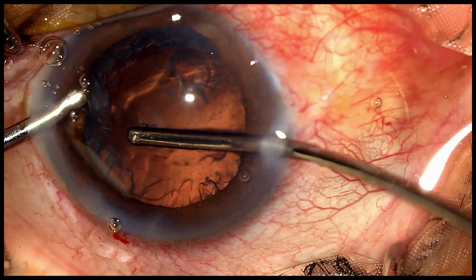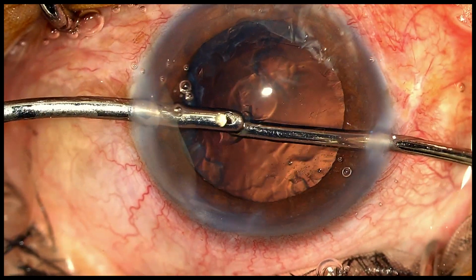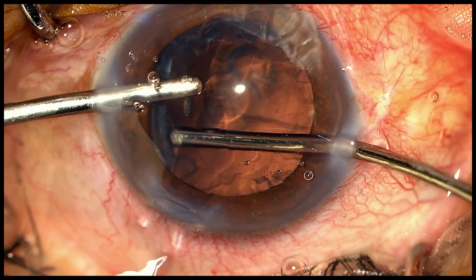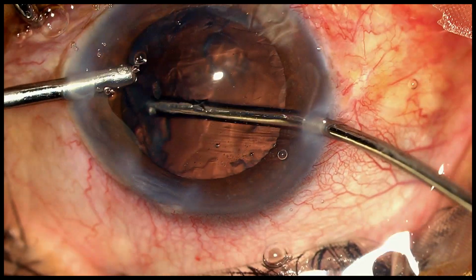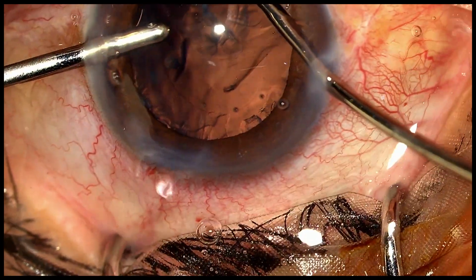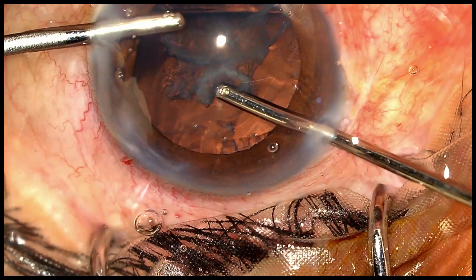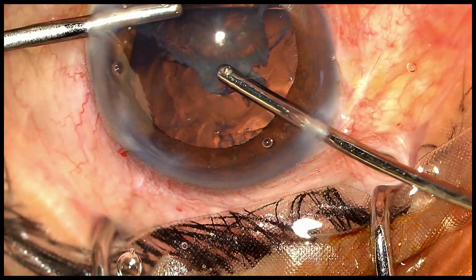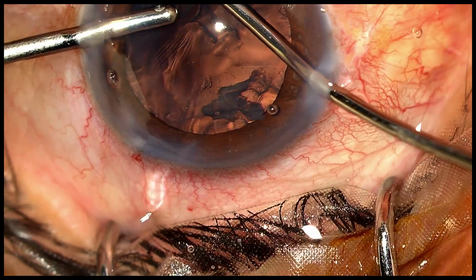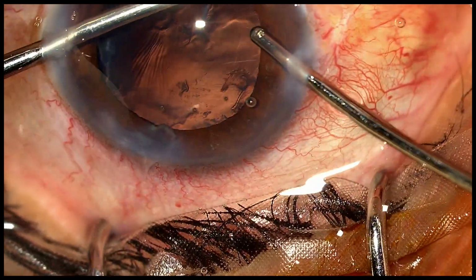Intermittently, I had to keep injecting some dispersive viscoelastic in the anterior chamber overlying the rent. With care and caution, I proceed with the removal of the epinucleus and the cortex. I'd like you to observe the irrigation held in the left hand. I always maintain the irrigation towards the angle. With the aspiration held in the right hand, I proceed to remove as much of the cortex that I can from the inferior and the left half.